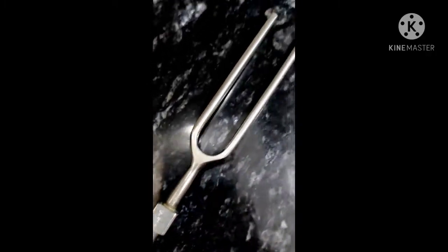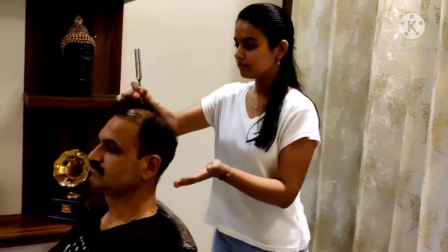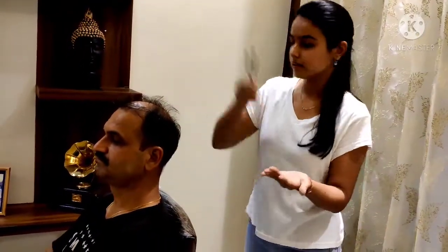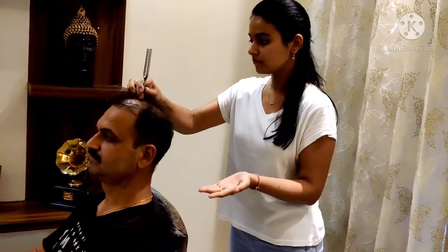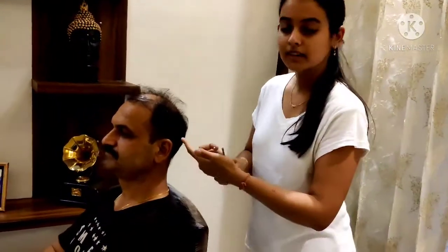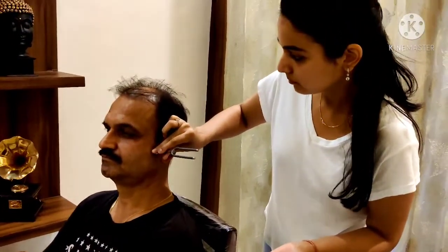Number 2, Weber test. Place the base of the lightly vibrating tuning fork firmly on top of the patient's head or on the middle of the forehead. Ask whether the patient hears the sound on one side or on both sides. Normally the vibration is heard in the midline or equally in both ears. If nothing is heard, try again, pressing the fork more firmly on the head. In unilateral sensorineural hearing loss, sound is heard in the good ear. Remember, in sensorineural hearing loss which is unilateral, sound is heard in the good ear.